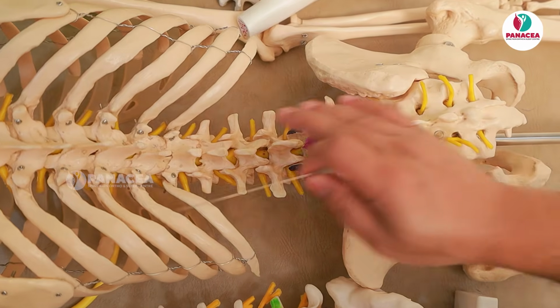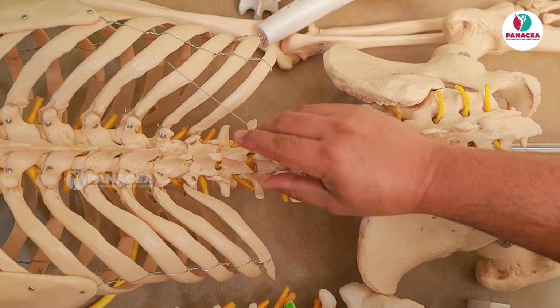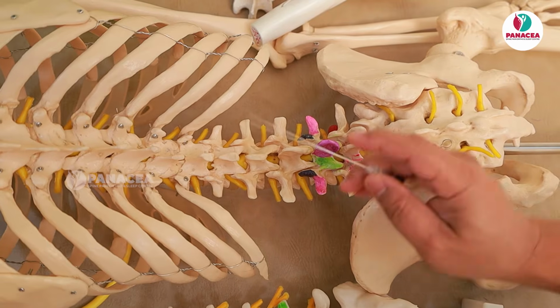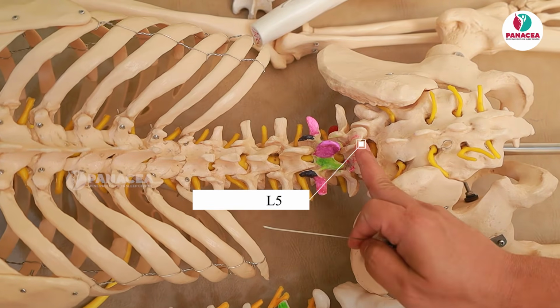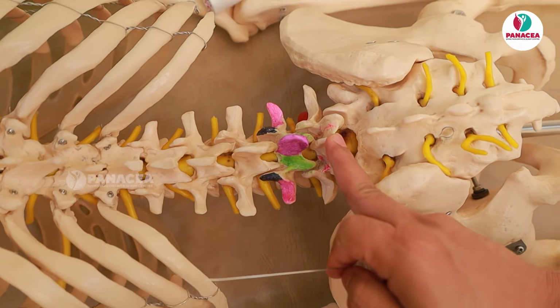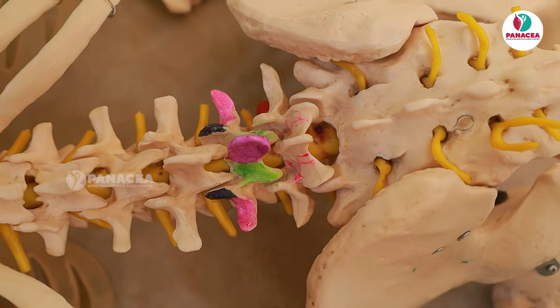First and foremost, we will place the patient prone on a pillow. This is L1, L2, L3, L4 and L5. Here first we will take an AP X-ray shot, then we go oblique.